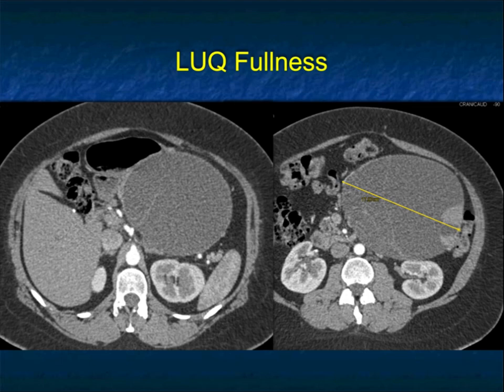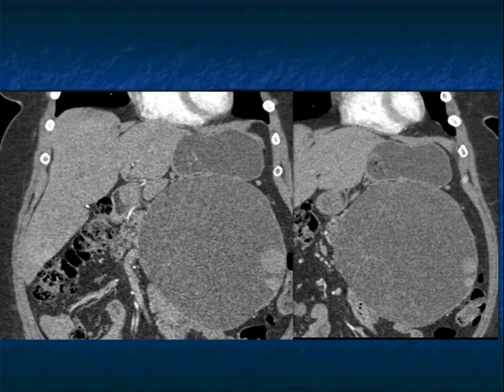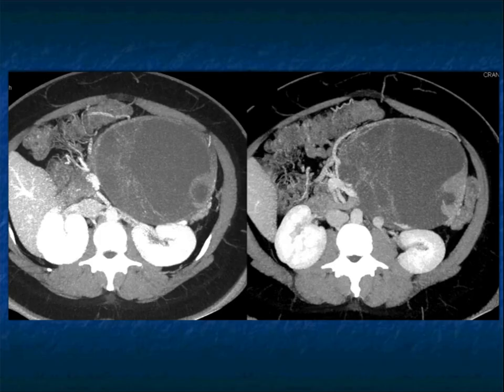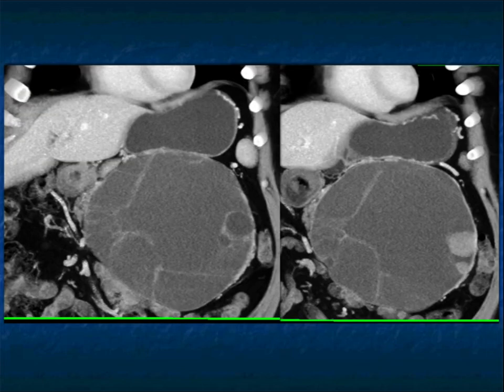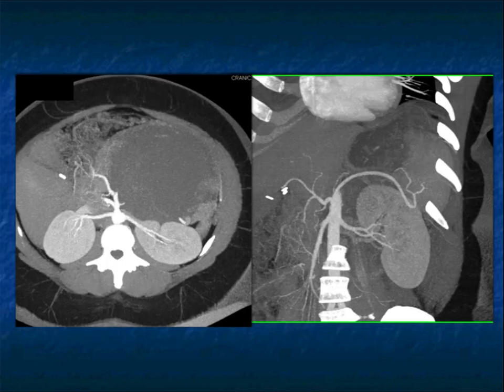Another patient with left upper quadrant fullness — you can see why. There's a mass, 17 centimeters. At about 3 o'clock, the mass has a solid component, and not surprisingly, this was an MCN with high-grade dysplasia. When you look through the lesions — axial, coronal, or 3D — that solid component at 3 o'clock is very concerning. When I see a solid component, I'm always worried about high-grade dysplasia at a minimum, or carcinoma. This is shown nicely on the MIP imaging and volume rendering. From the septations, you're saying MCN; from the solid component, you're really talking about your concern. This patient would surely get a distal pancreatectomy and splenectomy. The vessels are not invaded — you can see the splenic artery is stretched. Classic with MCN: vessel displacement but not vessel invasion.